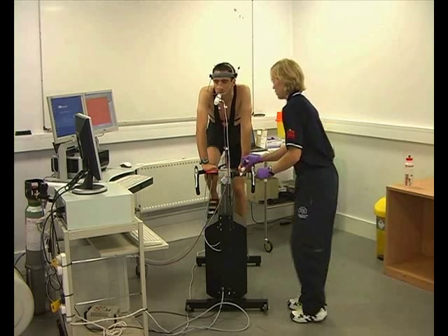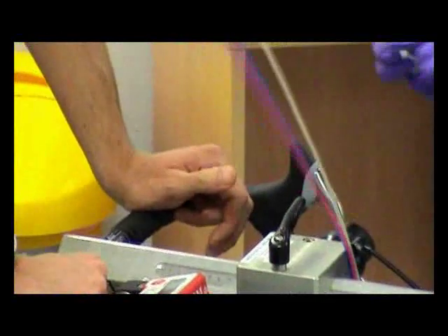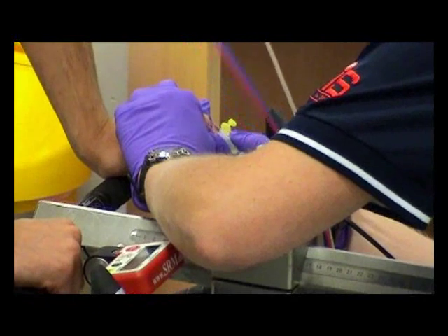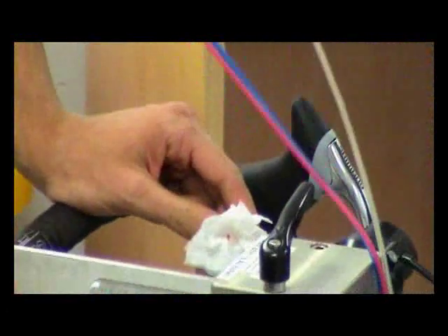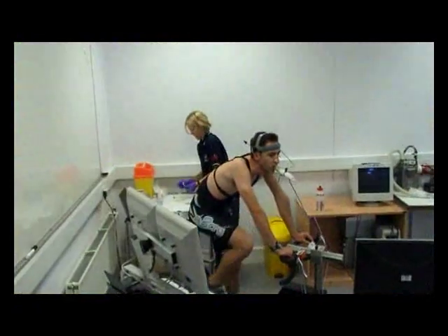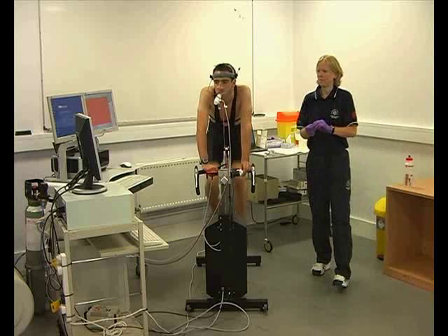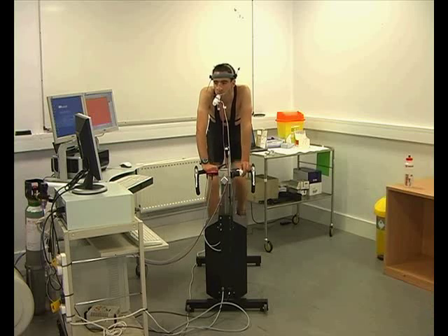We're now at the end of the stage of 120 watts, so it's time for another sample. It's quite common in these lactate threshold tests that the athlete will do 10, maybe 12 stages. This allows a thorough profile to be seen, from low intensity up until race pace. Let's leave our cyclist to it for a while and come back and see how he's doing later.